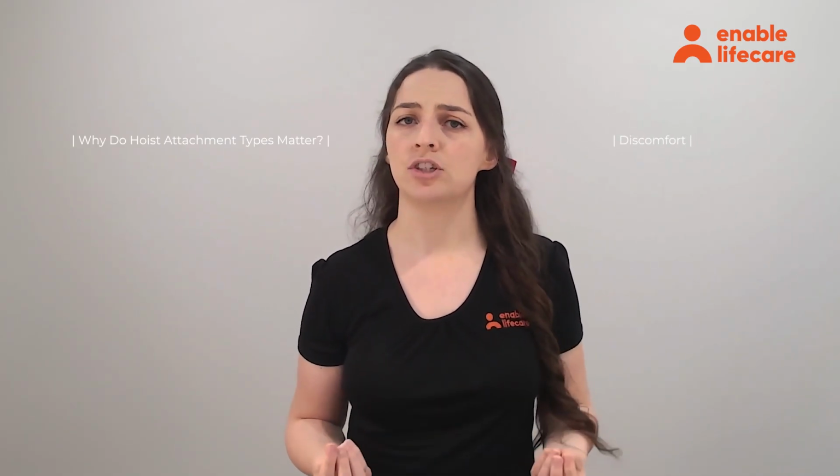So first things first, why do hoist attachment types matter? Well, choosing the right hoist attachment isn't just about getting someone from point A to point B. It's about ensuring safety, dignity, comfort, and efficiency for that specific client's needs. A poorly matched attachment can cause discomfort, so the sling positioning can feel too tight or too loose. There could be some instability, so the wrong spreader bar or yoke can make transfers unsafe. And then there could also be a risk to caregivers, because it might require awkward positionings to attach loops or clips, and that could possibly increase risk of injury.